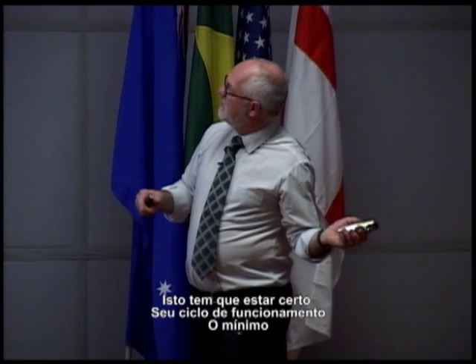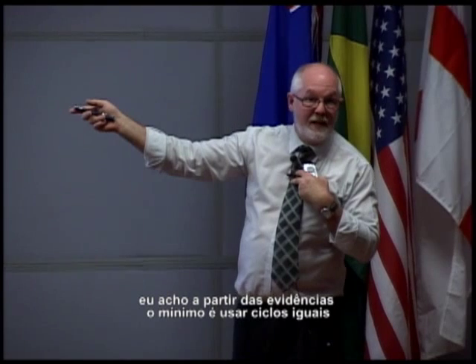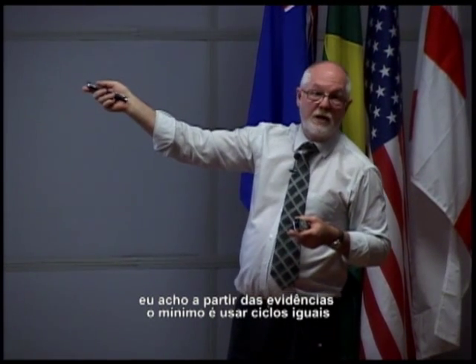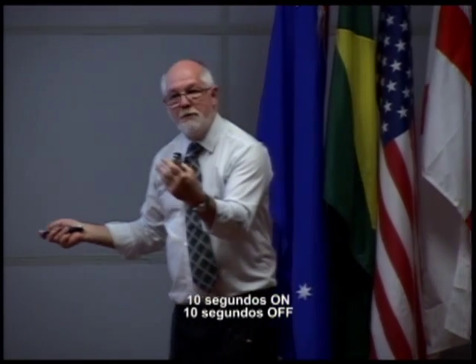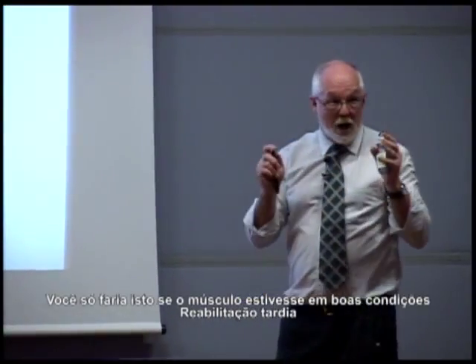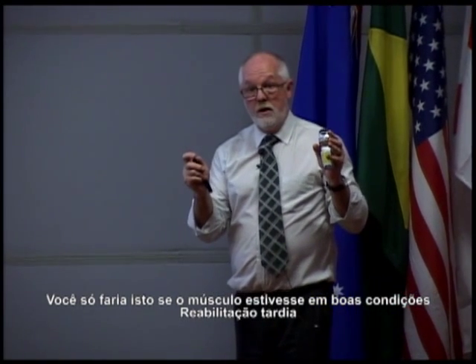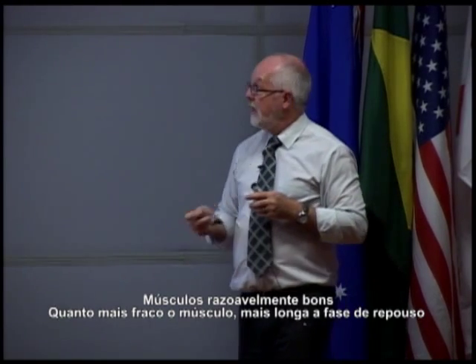So for your duty cycle, I think from the evidence, your minimum is to use equal cycles. 10 seconds on, 10 seconds off. 10 seconds on, 10 seconds off. And you would only do that if the muscle was in good condition. Late rehab, reasonably good muscle.